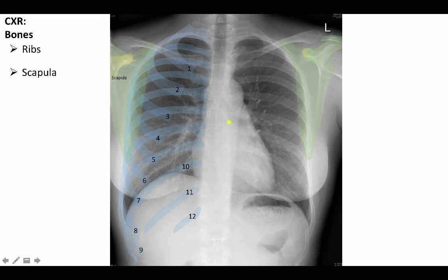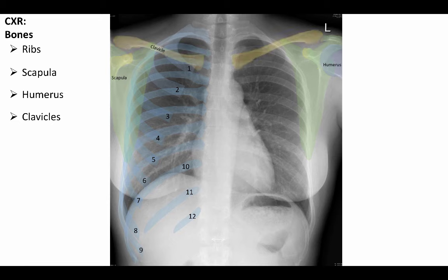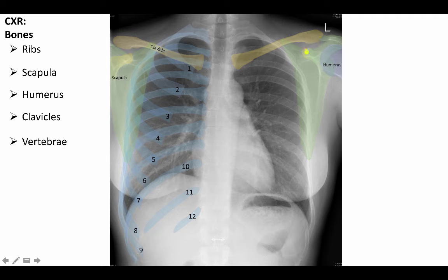We can see the coracoid processes of the scapulae here and here. We can see the head of the humerus occupying the glenoid cavity, sitting beside the glenoid cavity here. The clavicles are generally visible in their entirety. We see the medial sternal end of the clavicle articulating with the sternum at the sternoclavicular joint, and the acromial end articulating with the scapula at the acromioclavicular joint. We can imagine the conoid and trapezoid ligaments, which attach here, running to the coracoid process.